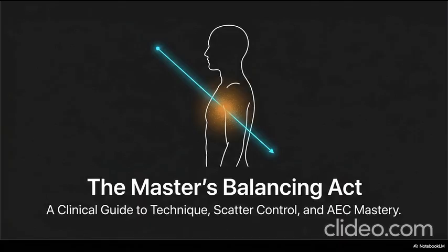That's a perfect analogy. And just like in archery, you have to balance the sheer volume of arrows with the necessary force to hit your mark efficiently. Which introduces a whole math problem. It does. This balance introduces a fundamental mathematical constant in radiographic physics known as the 15% rule. The 15% rule. Right. The relationship between penetrating power and raw quantity is not one-to-one. If you increase your kVp by just 15%, you are effectively doubling the exposure hitting the image receptor. Doubling it. Yep. And the reverse is also true. Decreasing kVp by 15% cuts the exposure in half. Which gives radiographers a massive tool for dose reduction, right?